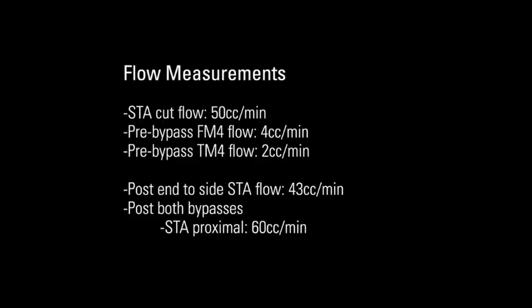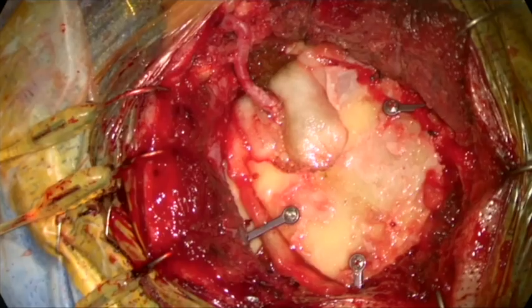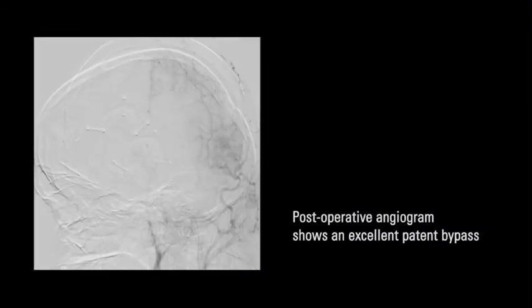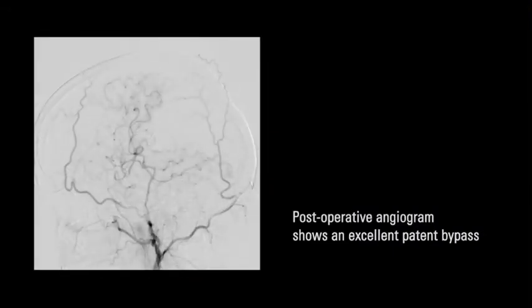And here is a list of all the flow measurements. Upon completion, the bone is replaced. Post-operative angiogram and post-op day 2 shows an excellent patent bypass.